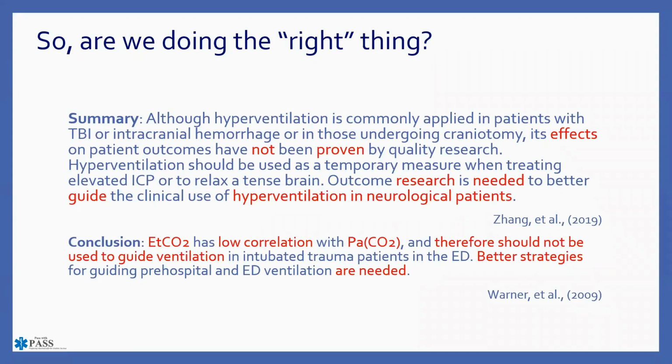The second study, the conclusion was end-tidal CO2 has a low correlation with PaCO2, and that's partial pressure of arterial CO2, and therefore should not be used to guide ventilation in intubated trauma patients in the ED. Better strategies for guiding pre-hospital and ED ventilation are needed. And again, this goes back quite a few years, back to 2009. But what Warner and folks were saying is that end-tidal CO2 really doesn't correlate with the blood CO2. Therefore, we should not be using it to guide ventilation.